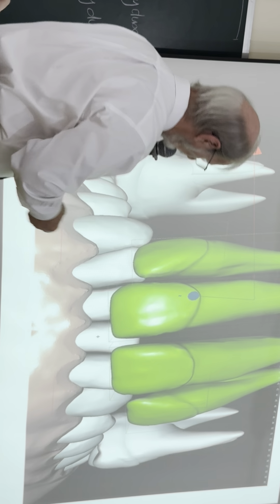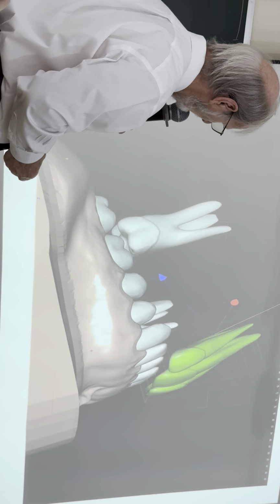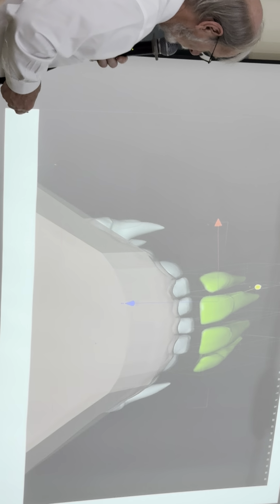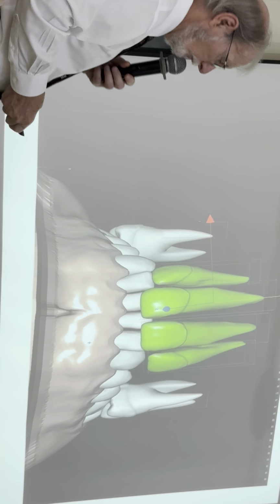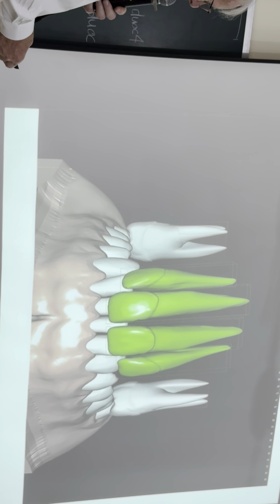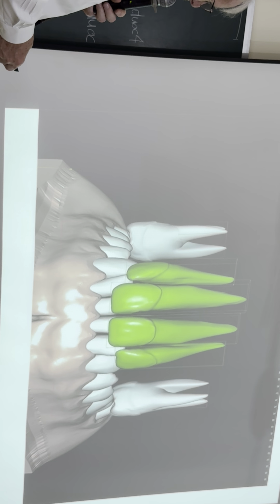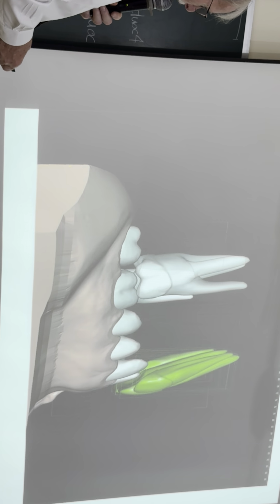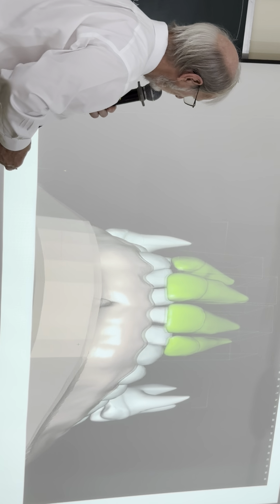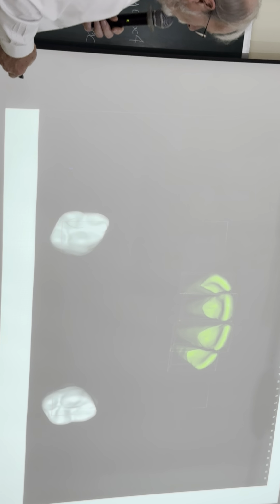Okay? Well, then I'm putting it on my simulator, I'm looking at it, and I say, okay, I need to do better than that. So there's some overjet. That's not an aligner case, but it could be. And we start looking a bit more complicated. You see what I mean? We have a bit of a problem here. And then you say, well, this is what I need to do. Then you go there. Overcorrection. I need to go this way. Okay. This is getting better. And we should be fine. So that needs to be the problem you have to look at.